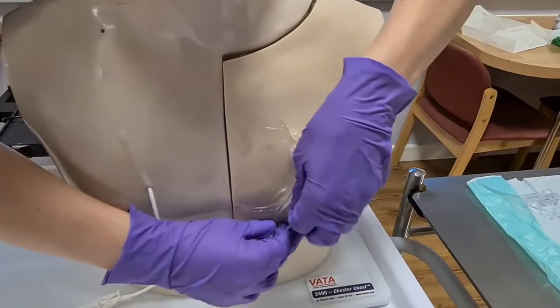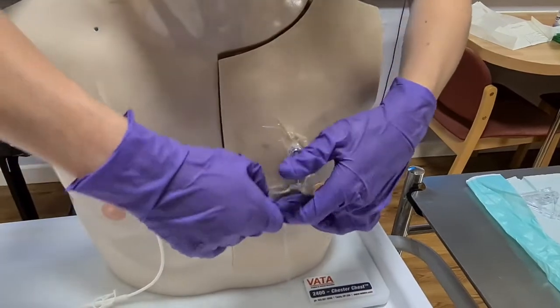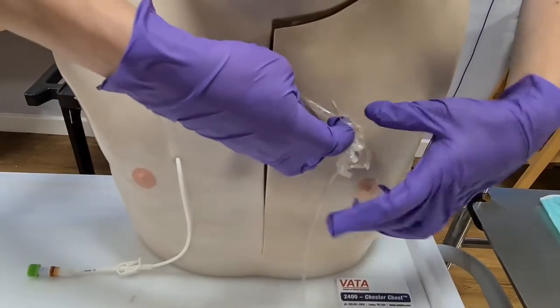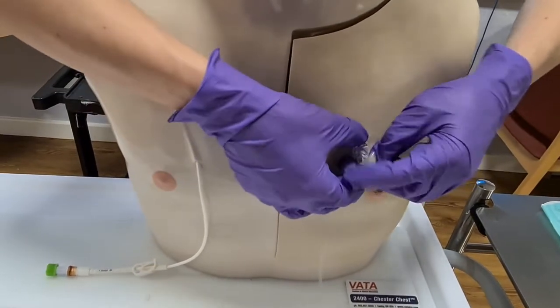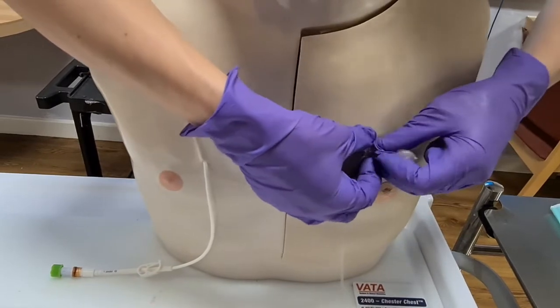Like so, very delicately. You want to be making sure that you have flushed the line before removing the line. So some areas need to be flushed by heparinized saline. It depends where the line has been inserted. If it's Guildford, they are just using normal saline.